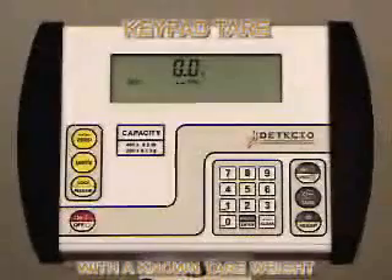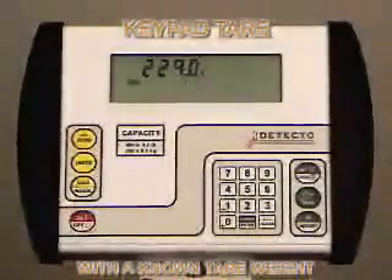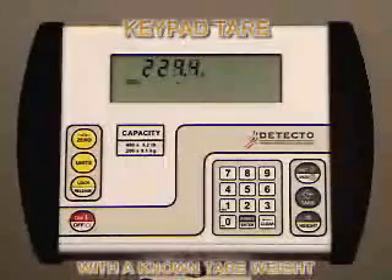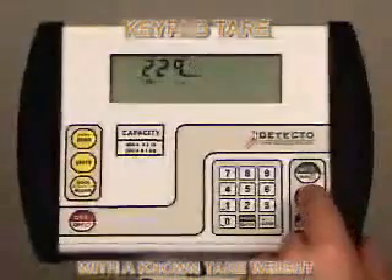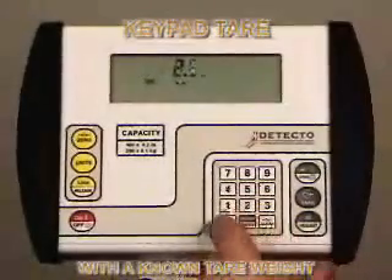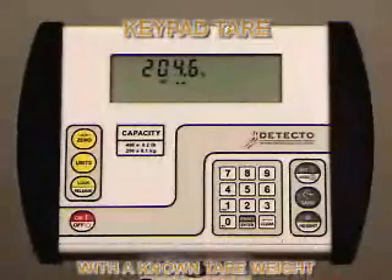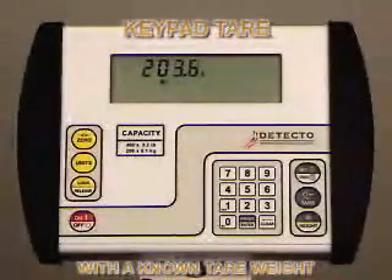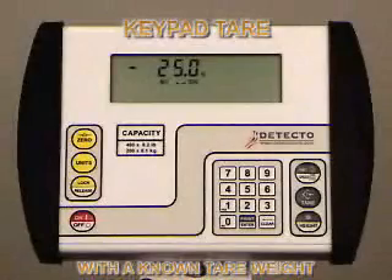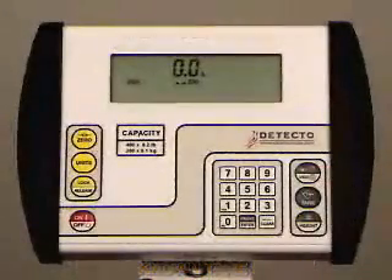For keypad tare with a known tare weight, place the patient and the wheelchair on the scale and press the tare key once to enter tare mode. Using the numeric keys, type in the tare weight and press the enter key — in this case, the wheelchair weighs 25 pounds. The indicator will enter net mode displaying the weight of the patient only: 204.6 pounds. Remove the patient and the wheelchair or walker. The indicator will display a negative net weight. Press the gross key to return to normal weigh mode.